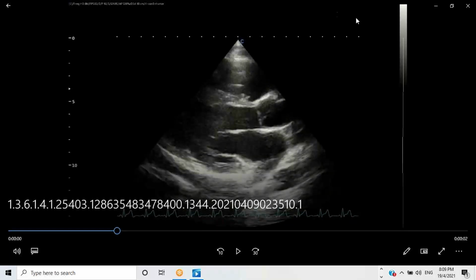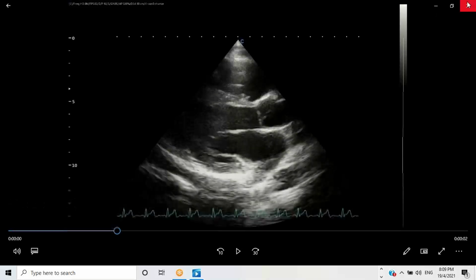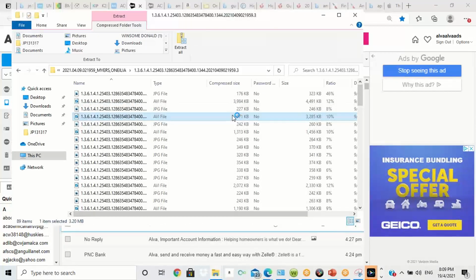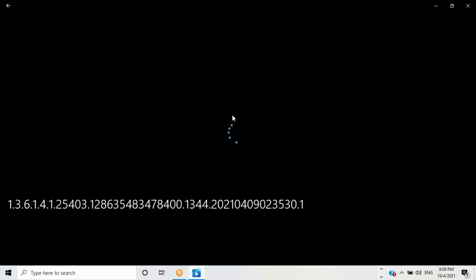your parasternal view looks like. So we do Doppler for all of these different images. We do Doppler because the Doppler allows you to pick up if there's any regurgitation, if there's any abnormal flow, shunts.